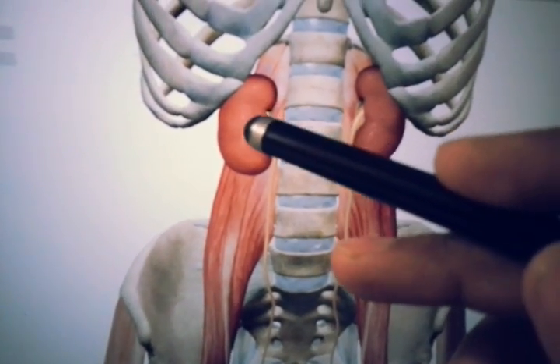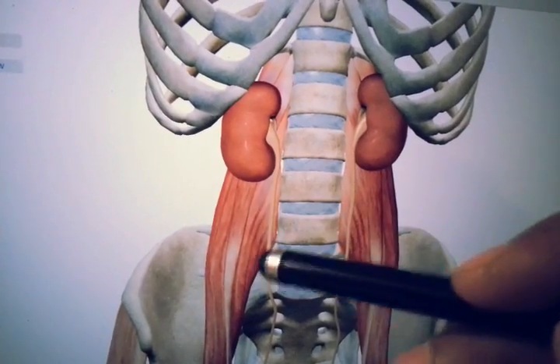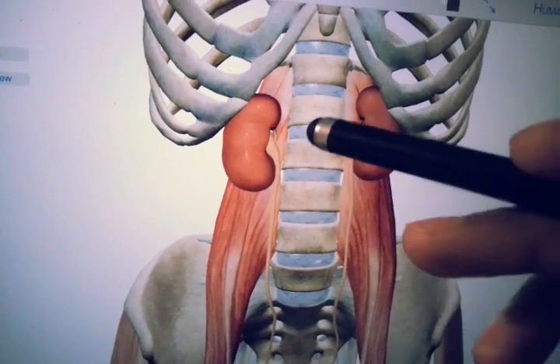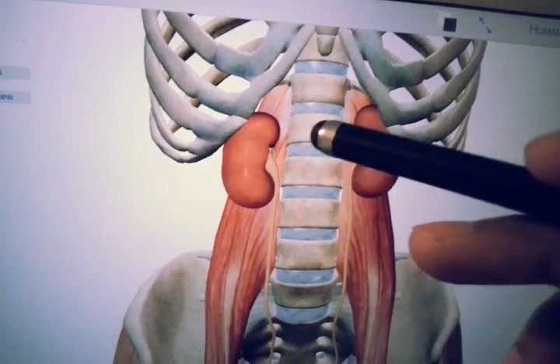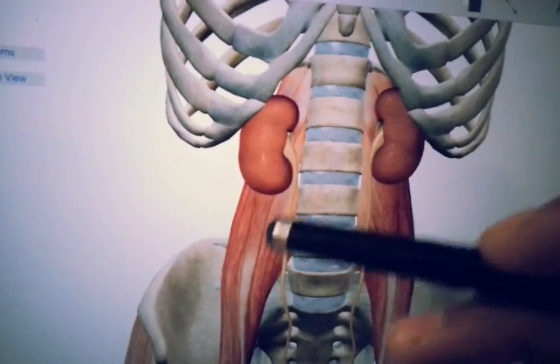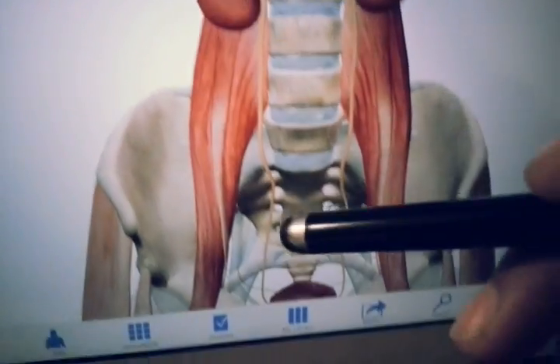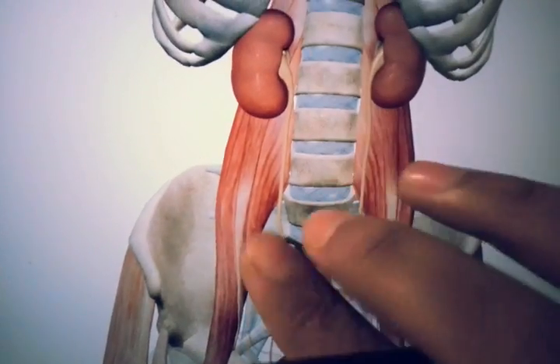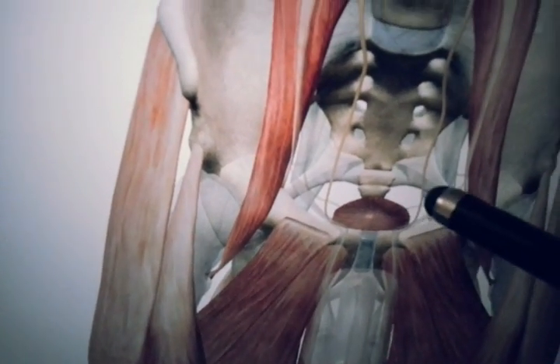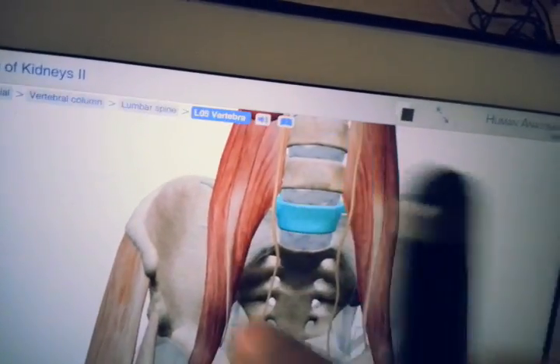The ureters run in line with the transverse processes of the lumbar vertebrae. We can also see the psoas muscle, which will appear as a shadow on the X-ray film as well. The ureters then travel down to the bladder area, and here we can see the ureters opening into the bladder, within the pelvis.